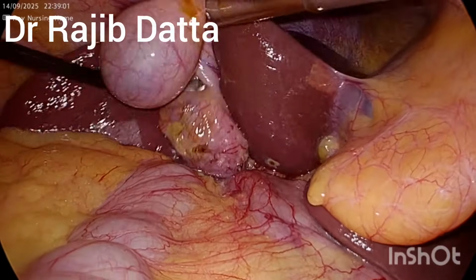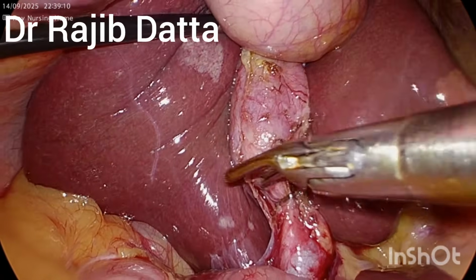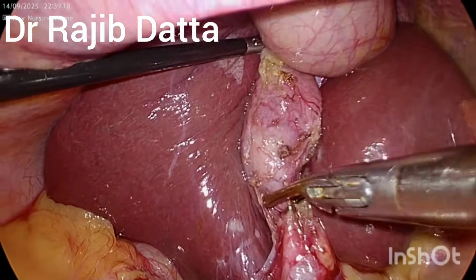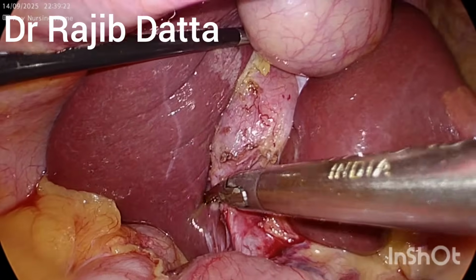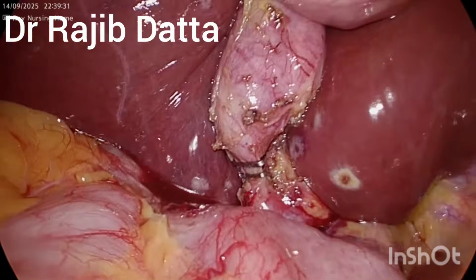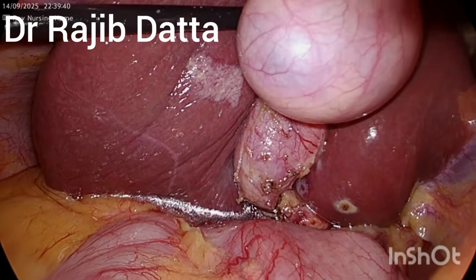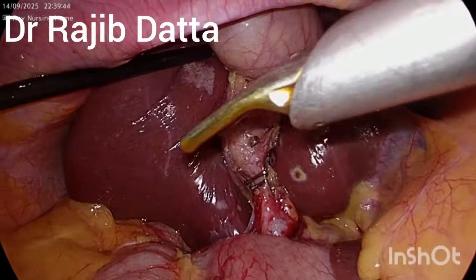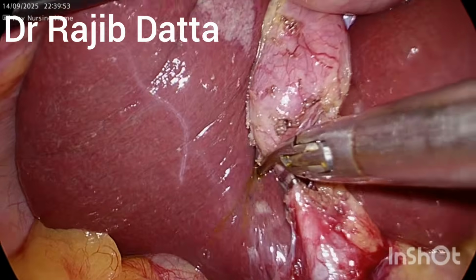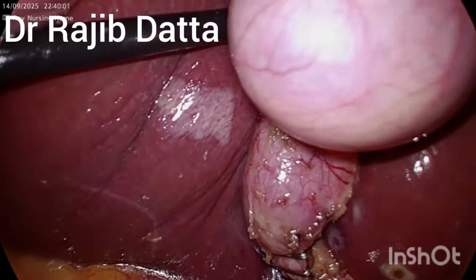Now again, another 400 Liga clip has been applied just distal to the previous clip. And now another 400 Liga clip has been applied, making a room or space in between the proximal two and the distal one clip.